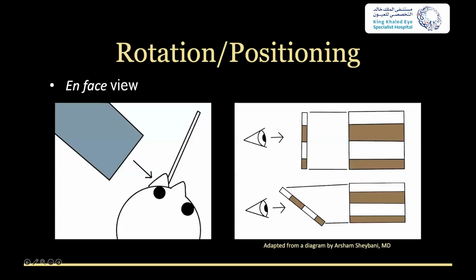This is a diagram I adapted from Dr. Shabani, but if you have a nice en face view, you can see how the whole angle anatomy opens up for you. If you're off at a slight tilt, you may still see your angle anatomy, but everything is going to be compressed, and it's going to make all of those landmarks much, much harder.